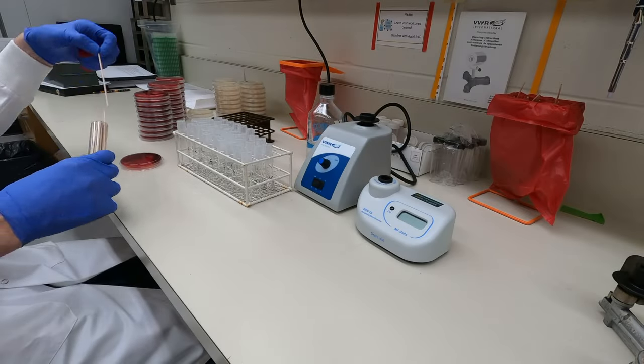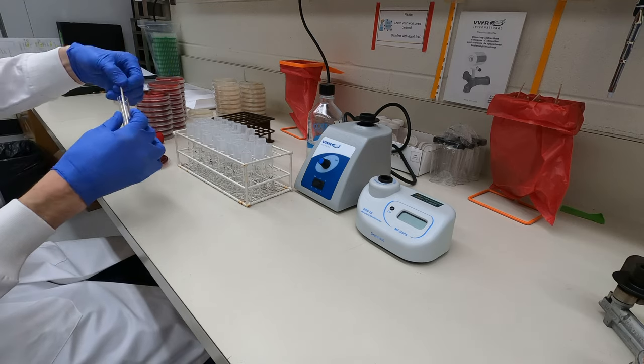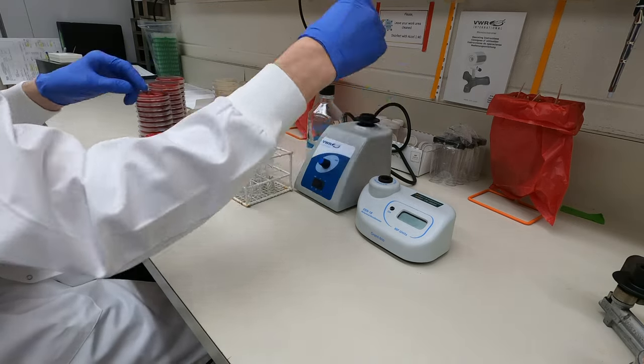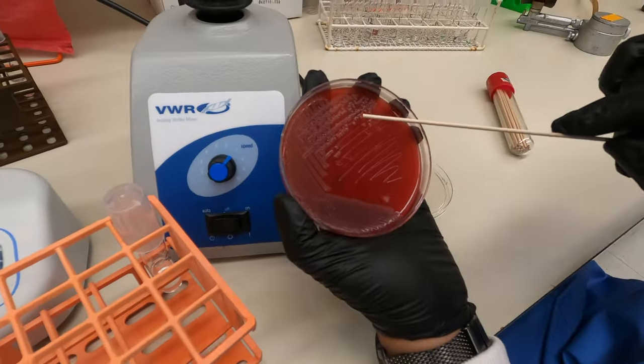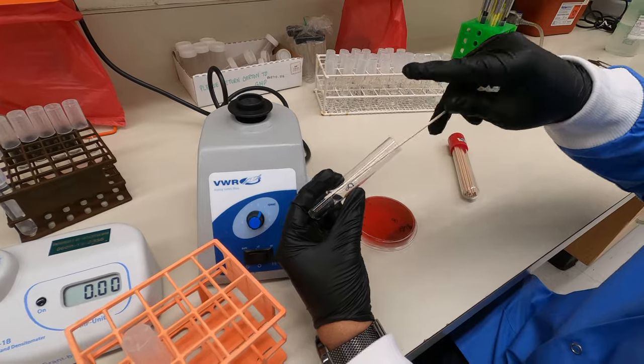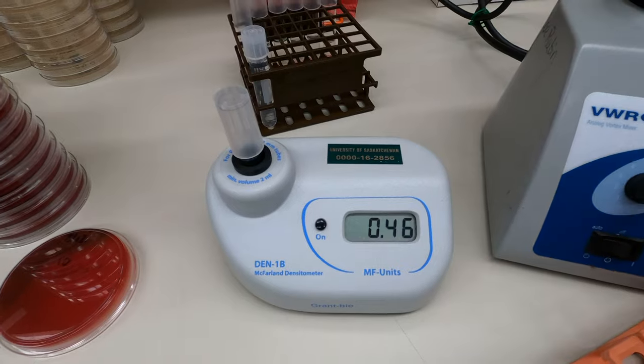Now that we have our media, we're ready to test our isolates. As with all susceptibility testing, we start by making a McFarlane 0.5 suspension of our organisms. As an additional quality control step, I make up this suspension using isolated colonies from the fourth streak on our plates. That helps me to be confident that I'm working with a pure culture.